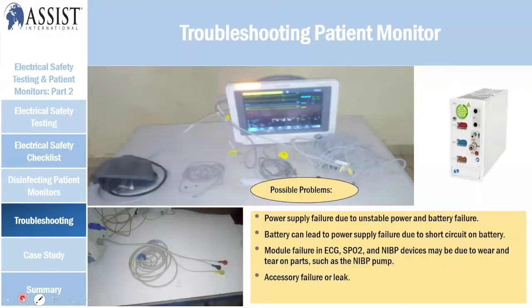So like NIBP, you've got issues like inaccurate results. Inaccurate cuff size, inaccurate cuff application, arrhythmia, irregular heart rate, rapid change of pressure, patient movement, all these can cause inaccurate results of the NIBP reading. So the cuff is not placed at heart level, all that. These are normally due to clinical issues. They don't apply things properly for NIBP. That may lead to your reading being inaccurate.